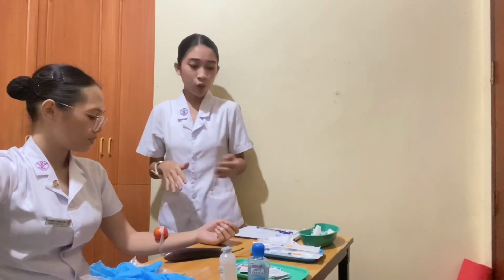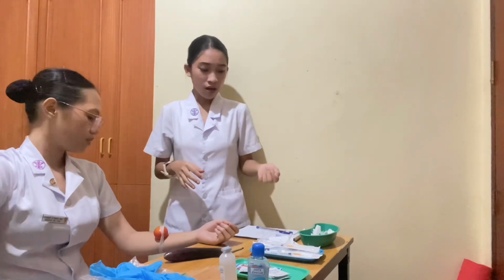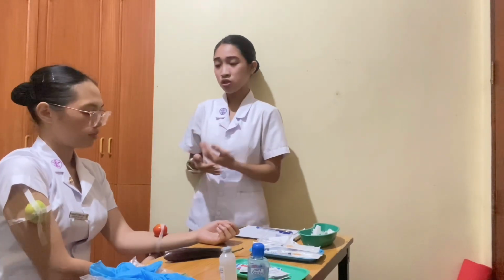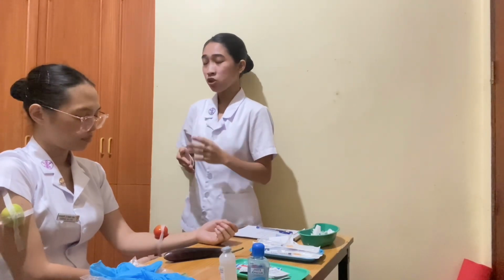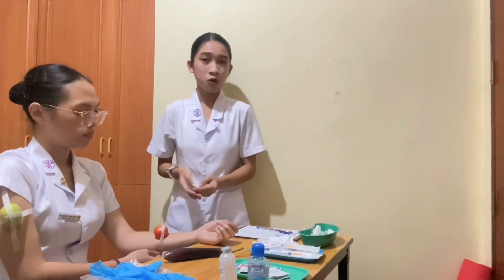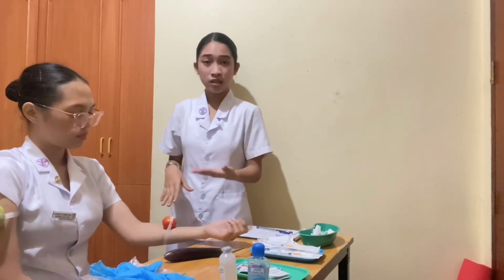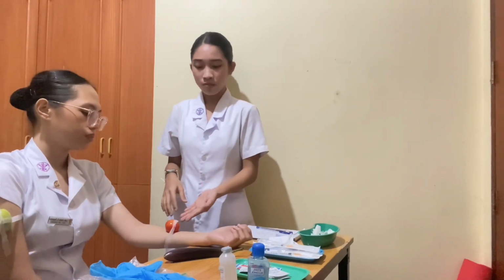This was ordered by your physician, Dr. Rivas, and I'm just going to do this to make sure that you don't have an allergy to the medication. Okay? Okay. Since we are improvising, I did attach the tomato on my patient's hand.